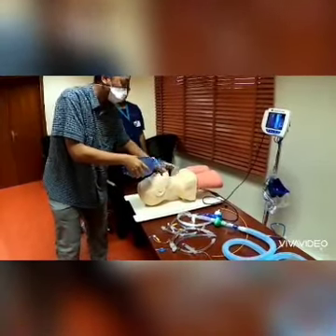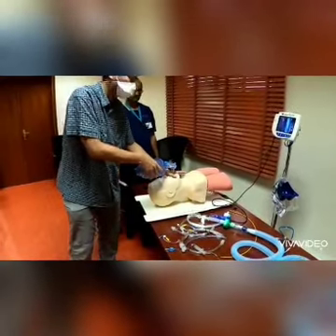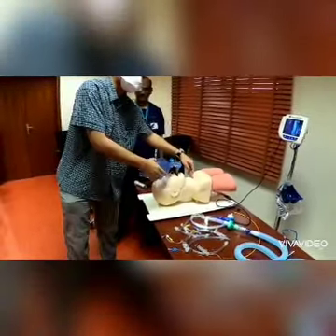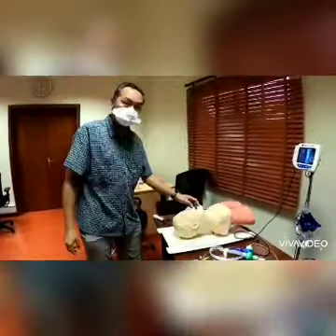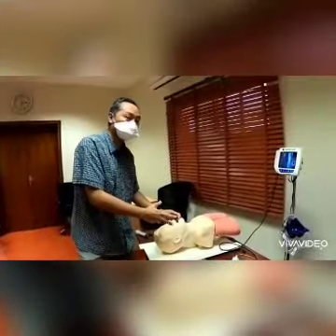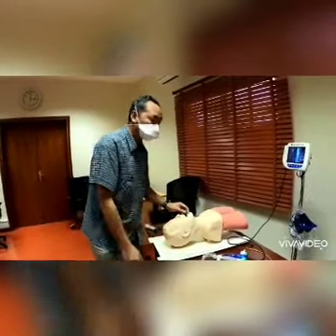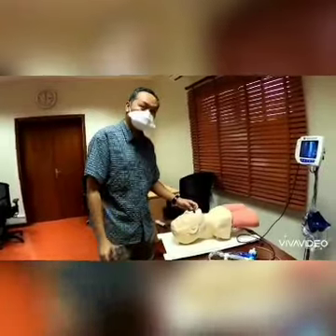If you cannot sense that the chest is rising, or if there is too much leak at the mouth, I suspect you'd have to proceed very quickly to surgical cricothyroidotomy as a rescue airway device. Just another reminder, make sure you prepare the correct size of laryngeal mask before you start your RSI process. Size 4 is for most adults in general, and 5 for bigger adults, and 3 for smaller.